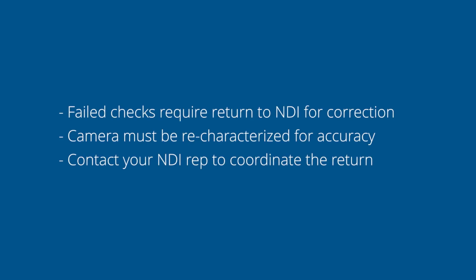If the accuracy check fails and an accuracy correction is needed, the camera must be returned to NDI for a recharacterization and accuracy correction. Please contact your NDI representative to coordinate the return.